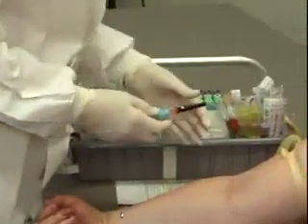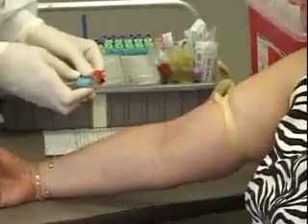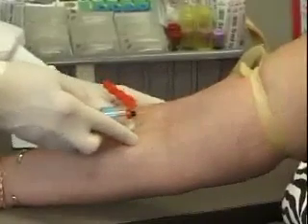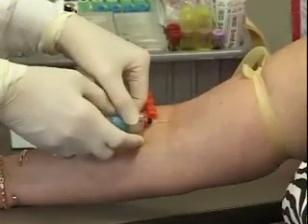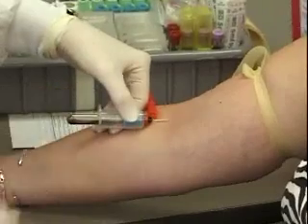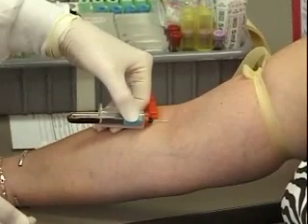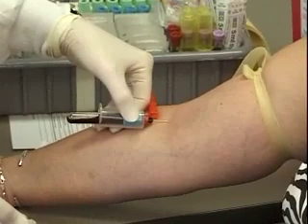I'm going to remove the needle holder cap and make sure that my bevel is up. I'm going to anchor the vein with my thumb, pull the skin taut, and enter the skin in a quick fluid motion. Notice that the tube is not pushed onto the holder onto the needle until I've entered the vein — if you push the tube on before you enter the vein, the vacuum will be gone out of your tube.